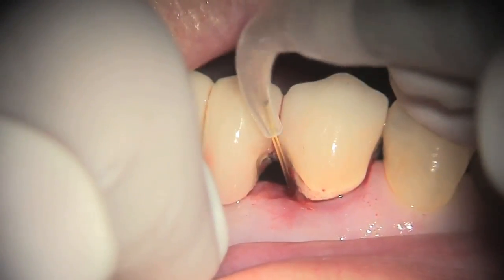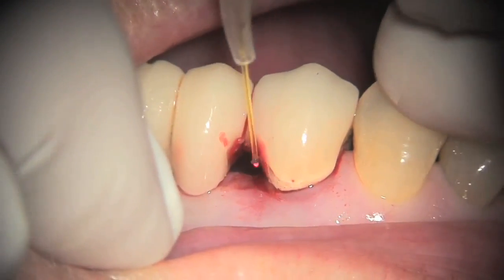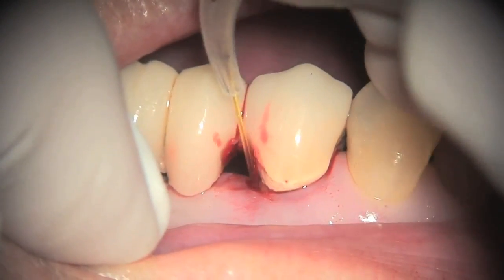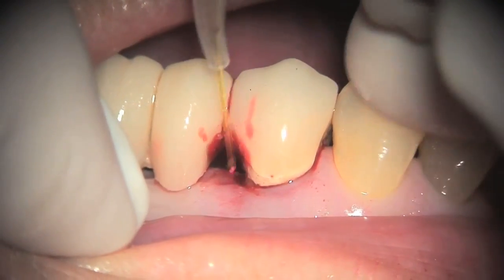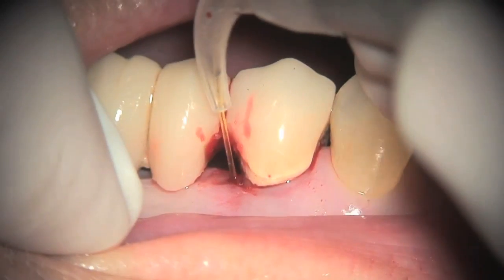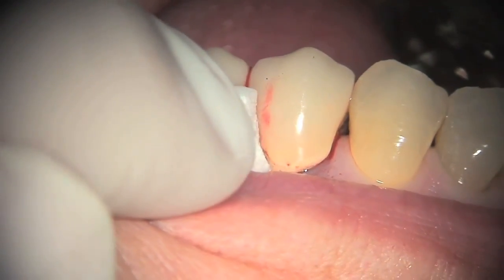The second pass with the Nd:YAG laser is used to start the formation of the clot. Place the tip in the sulcus to the bottom, activate the laser, and gently pull it out — this will start the clot formation. Notice how the blood starts to turn a slightly darker color; at this point is when you stop and start placing the collagen.